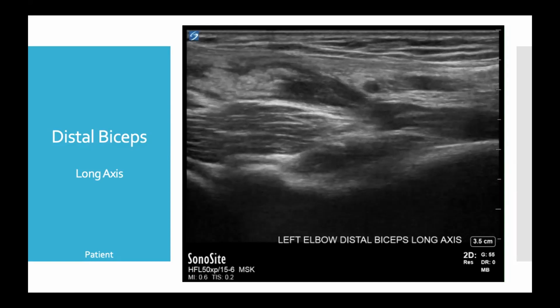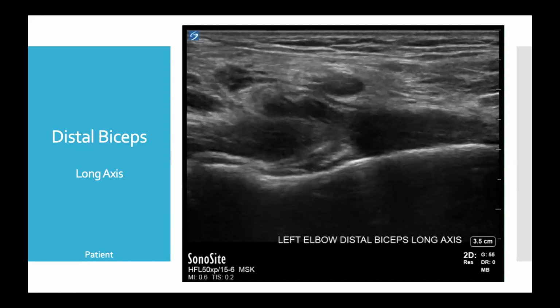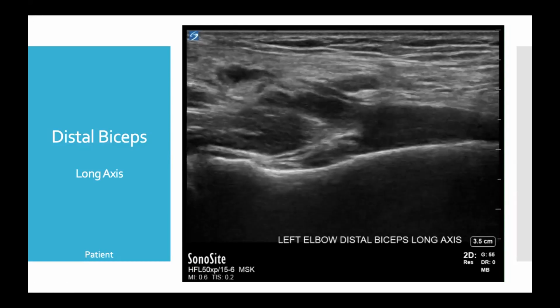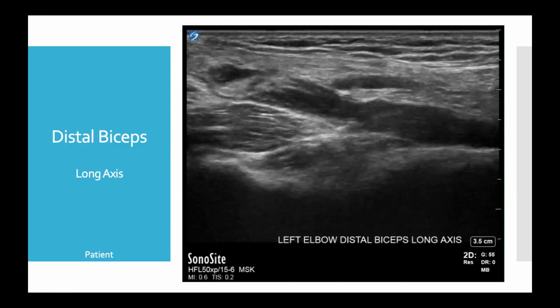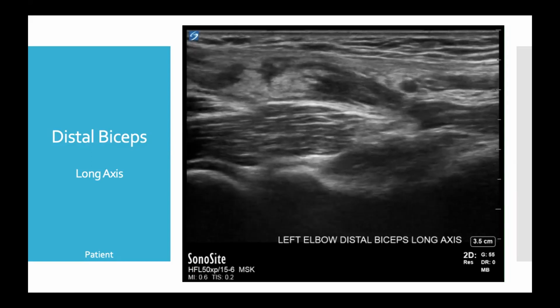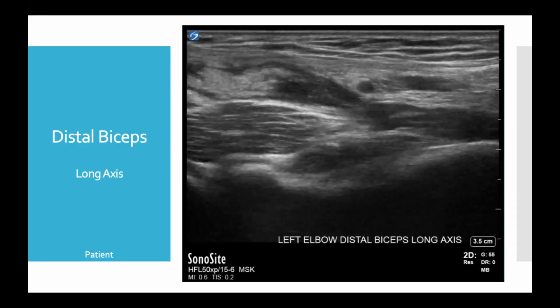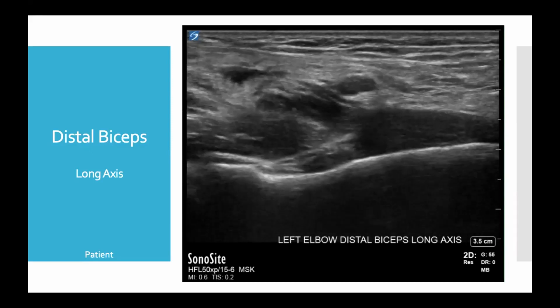However, what's lacking is that tight fibrillar pattern. We can see it maybe very faintly, and there could be maybe scant fibers that are still there, but for the most part, it's a void where the tendon should be.